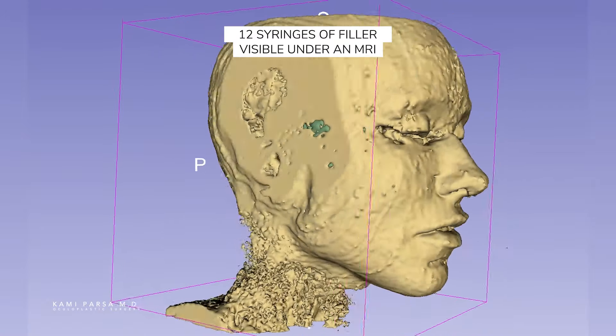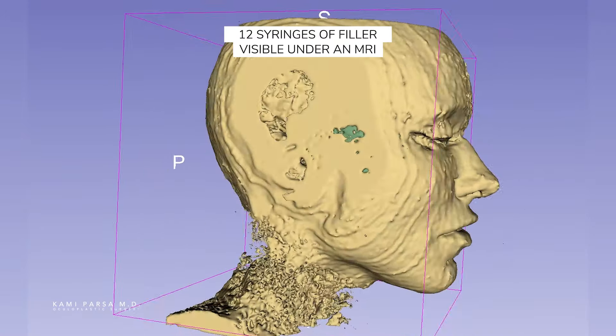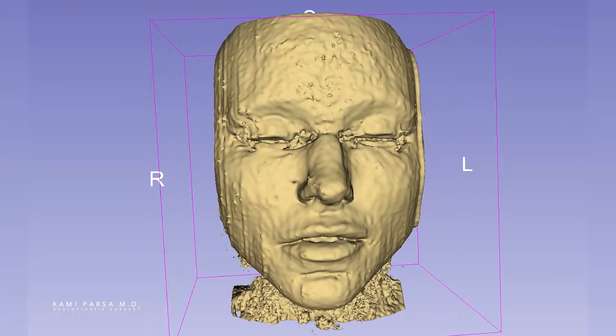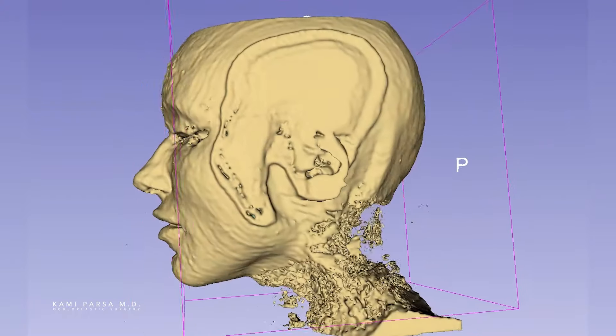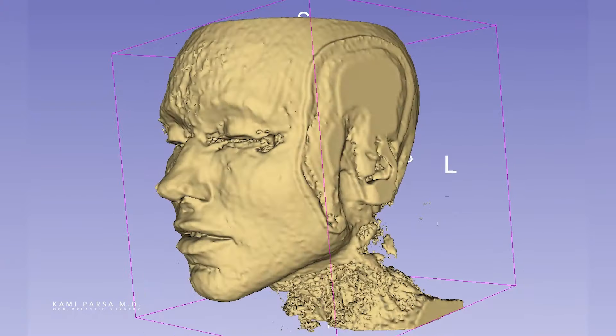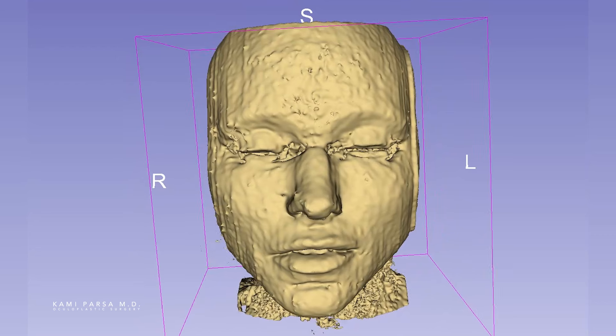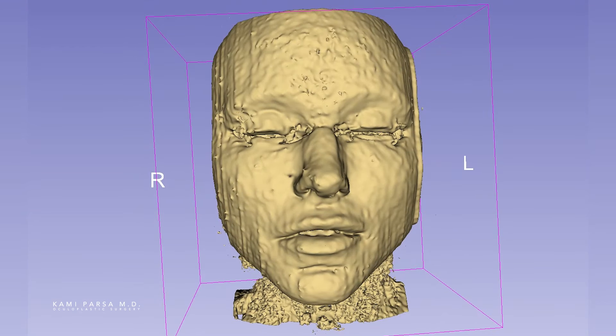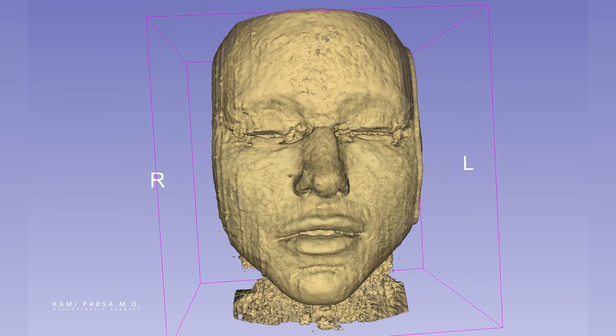So what you're looking at here is an MRI image of a 33-year-old patient who had over 12 cc, which is 12 syringes of hyaluronic acid filler injected to her face over the past six years.